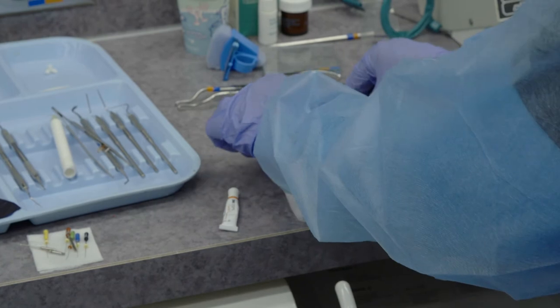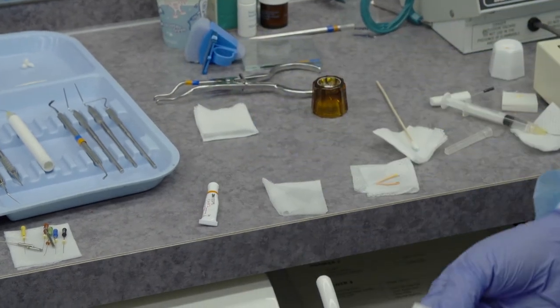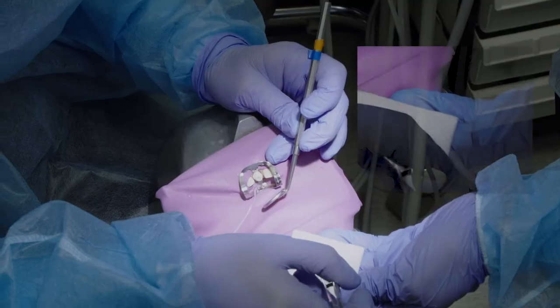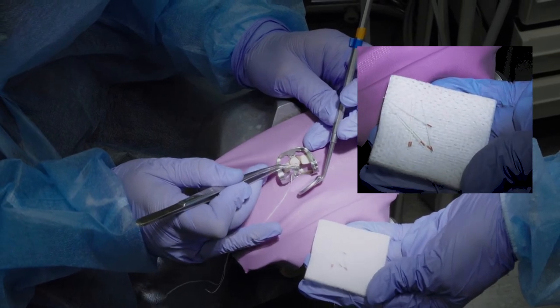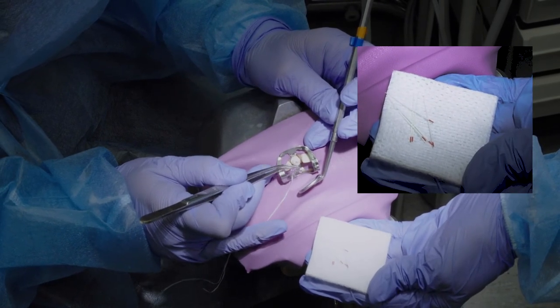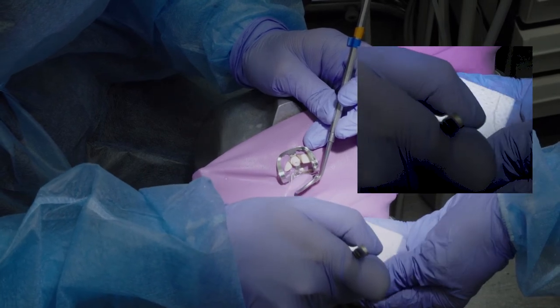The assistant will then pass utilizing the locking pliers. Make sure that you have the paper points facing in the direction where they're to be placed so it makes it easier for the dentist. And they'll utilize the other side of the 2x2 to place the dirty paper points.